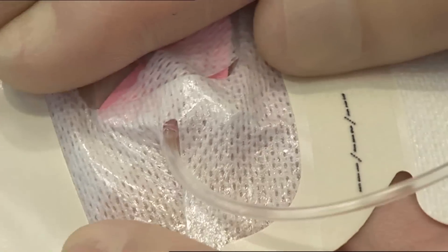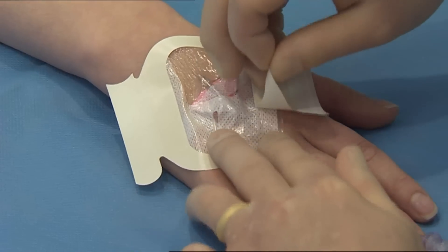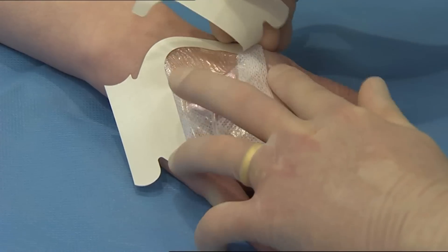Cross over the soft cloth sections under the catheter hub. Remove the paper frame, smoothing the dressing edges to increase adhesion.